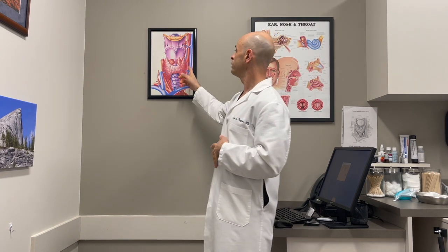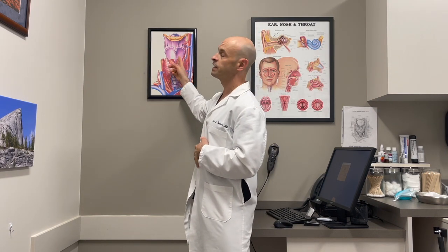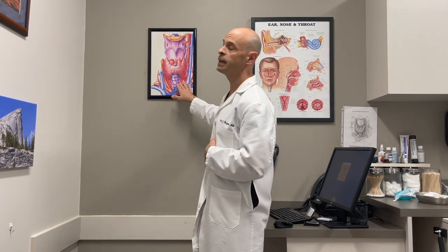And then, very importantly, after you've removed the gland from one side, you can go and touch the nerve again to make sure that you still have your stimulation, your beeping noise coming from the device. This is crucial because you are very unlikely to really injure the nerve during thyroid surgery, but it can happen.